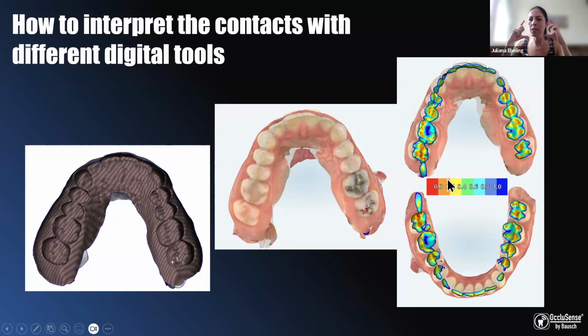So what do we know? That this movement from the ligament is about 100 microns. So if I have teeth against teeth, I have a possibility of 200 microns of this movement. So I can analyze until 200 microns from the occlusogram, the distance from these meshes.